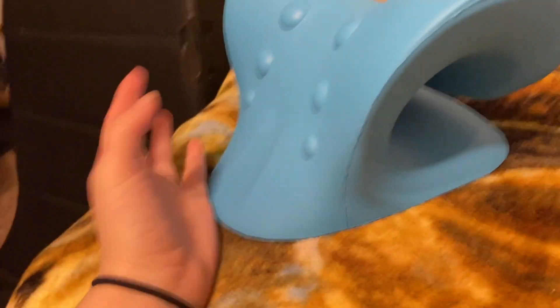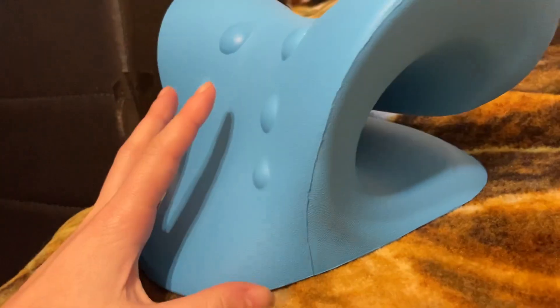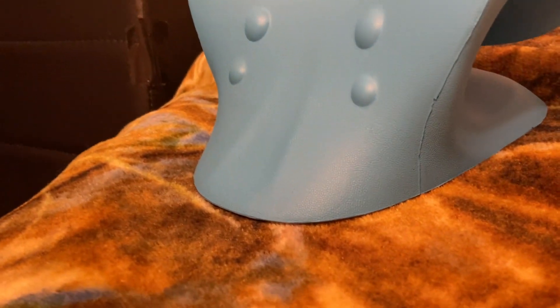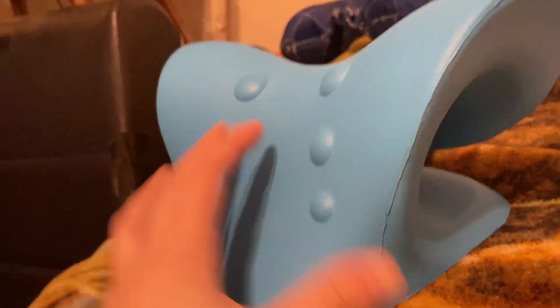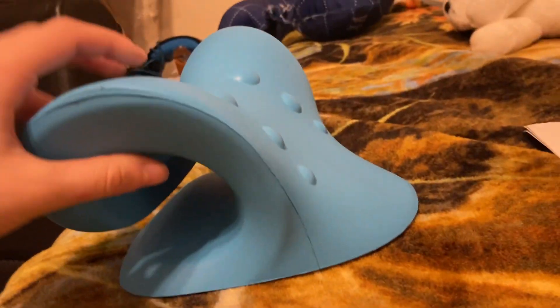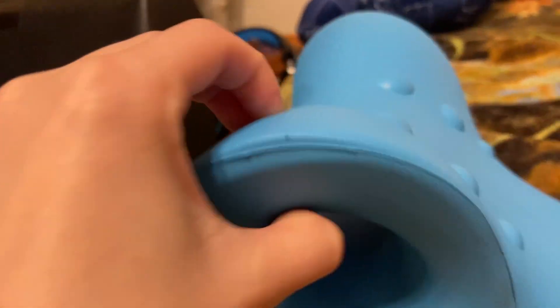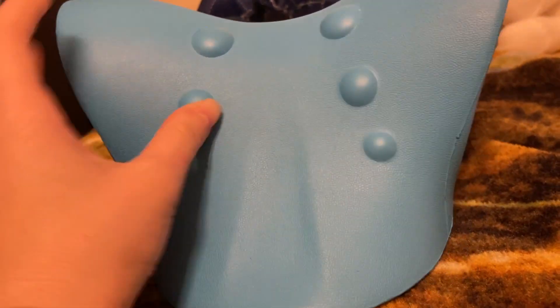It does work in the sense that when you put your neck right here, the curve aligns very well to give you that really good disconnection between your head and your neck — the traction. So it does provide traction, but it's just so uncomfortable to lay on because it's so hard.